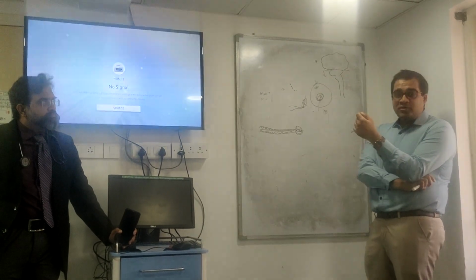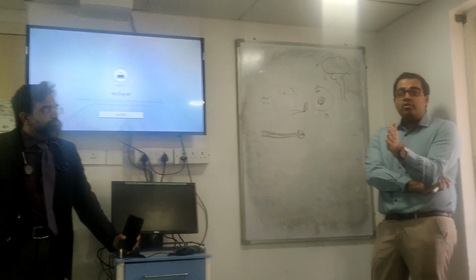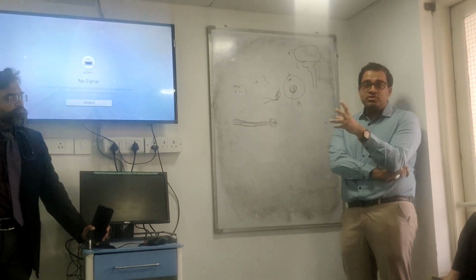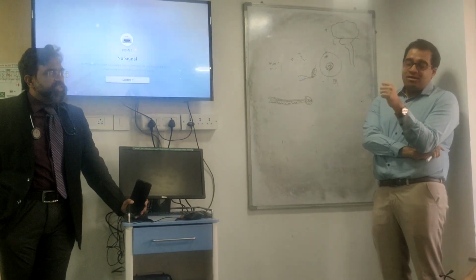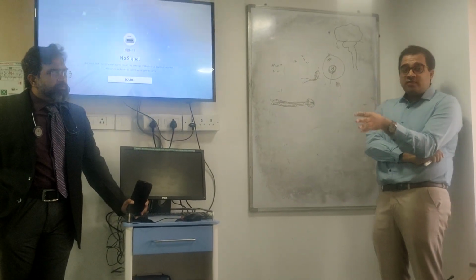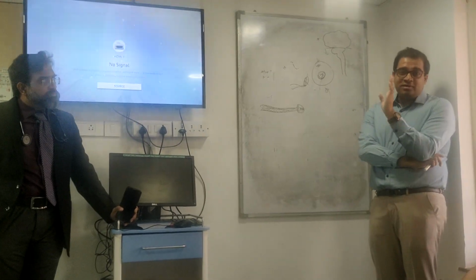Also for skin and soft tissue infections, since they had a separate orthopedic ID unit for infected cases, they used to inoculate pus in these bottles and send. Even ascitic fluid we've sent. So we use these bottles for everything other than urine.